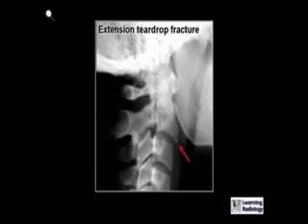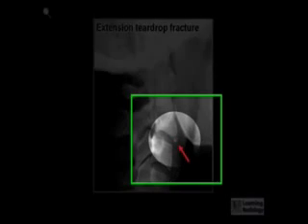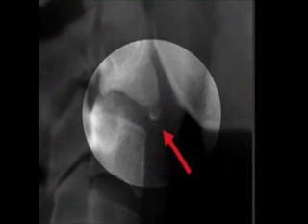This is an extension teardrop fracture, which can sometimes be the only clue to the presence of a hangman's fracture. The red arrow is pointing to a small avulsion-type fracture from the anterior inferior aspect of the body of C2.